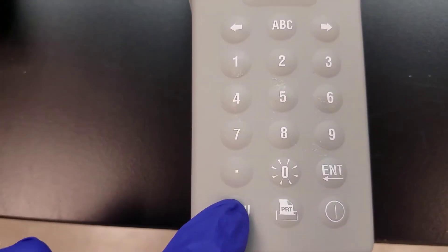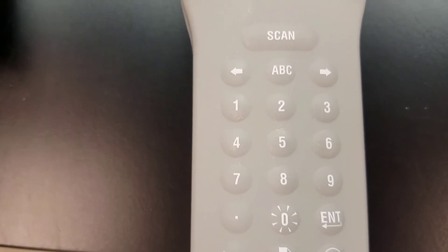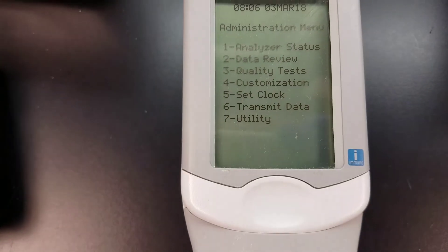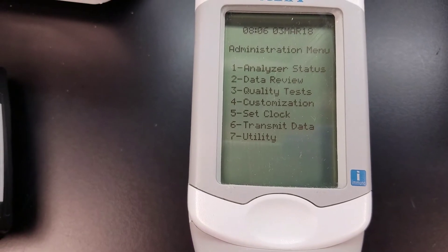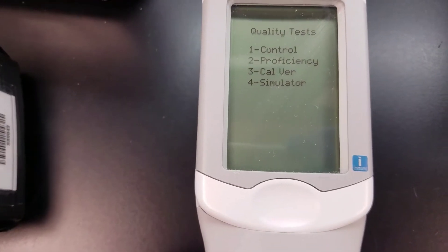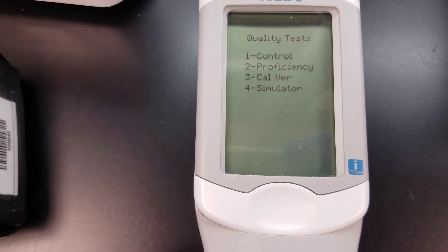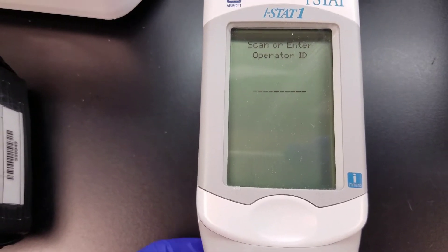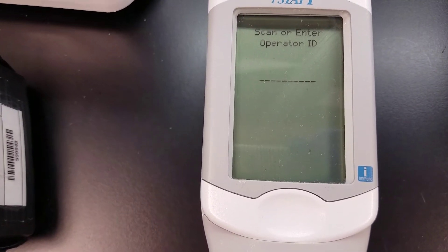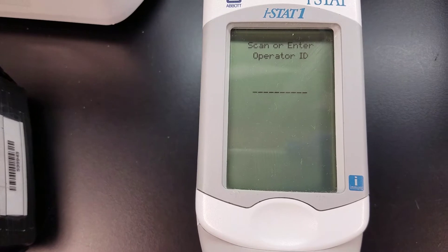What we're going to do is first go down to menu, so hit menu, then go to quality tests, and then click on the option for simulator.